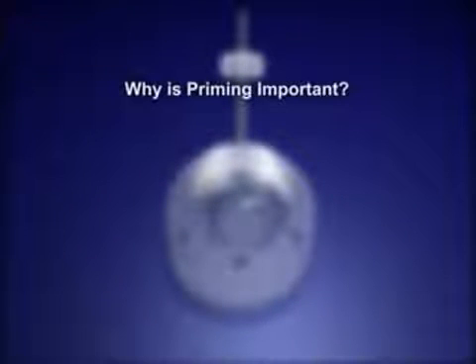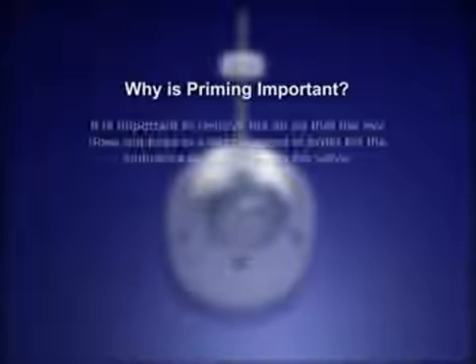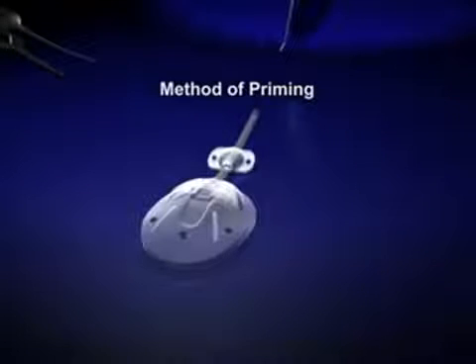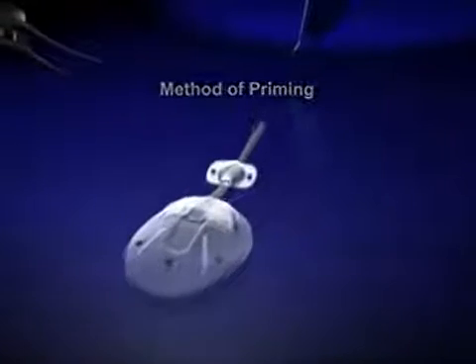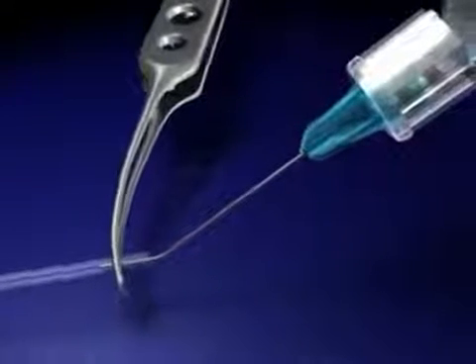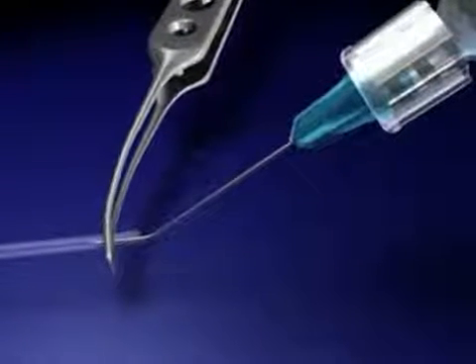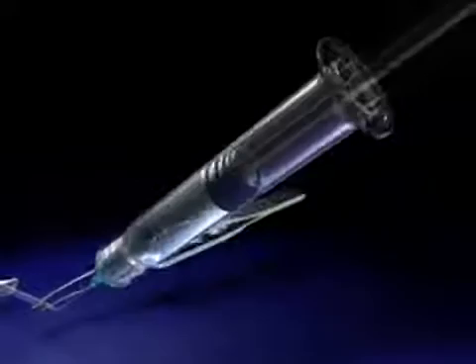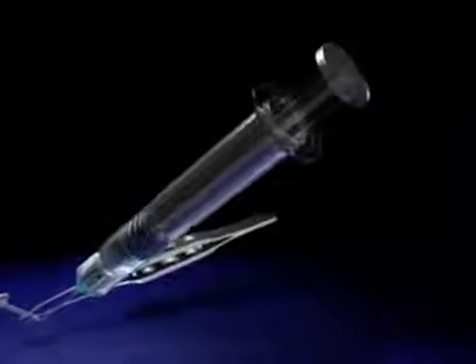Why is priming important? It is important to remove the air so that the eye does not have to exert pressure in order for the aqueous to pass through the valve. Priming is accomplished by injecting 2cc balanced salt solution or sterile water through the drainage tube using a 26-gauge cannula. A lot of force is required to push the fluid through the tube with the pars plana clip.